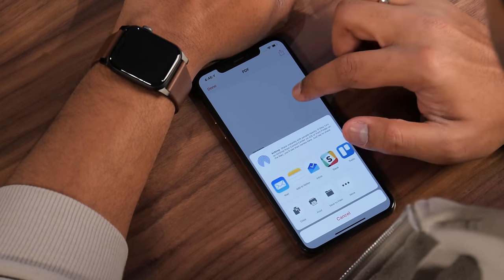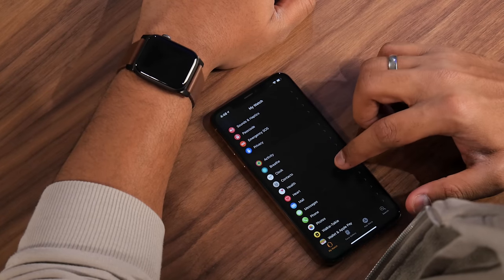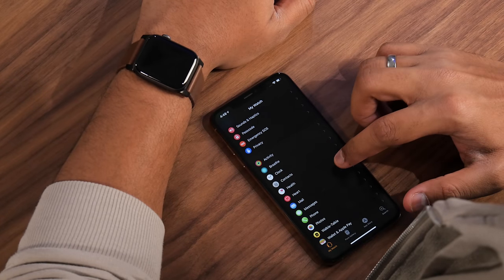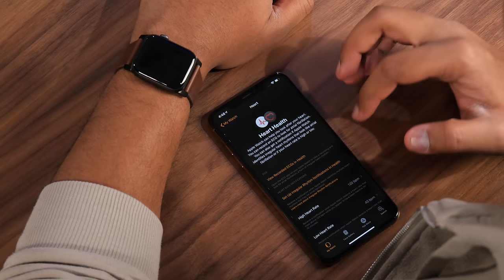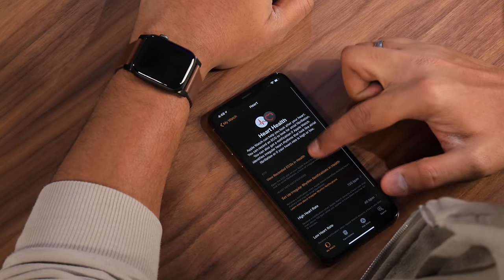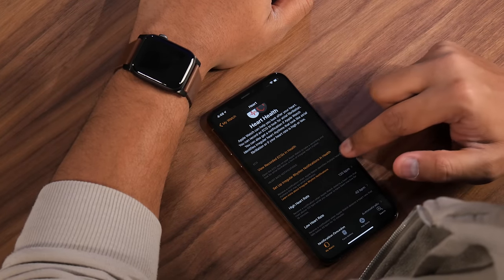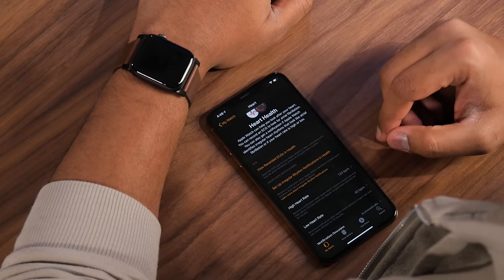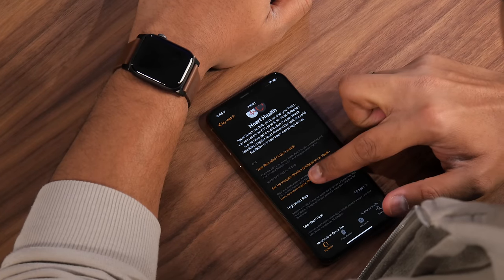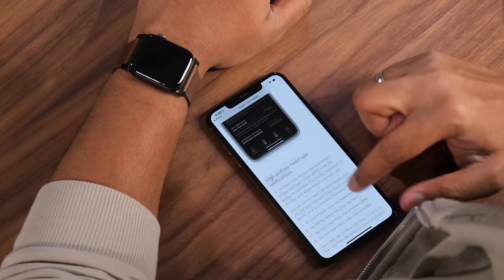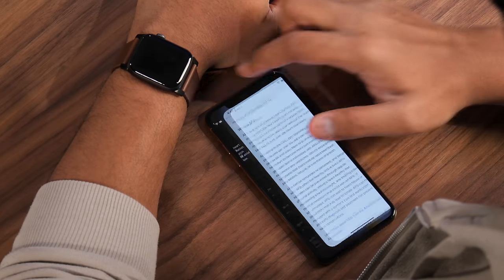Now that you've set up the ECG app, you can also set up irregular heart rate notifications. Go back to the Watch app, tap on Heart, and you can see that the ECG has been set up. It now says set up irregular rhythm notifications in Health. This helps identify atrial fibrillation as well — you can tap Learn More to read about how it works and why it's useful to track this data.